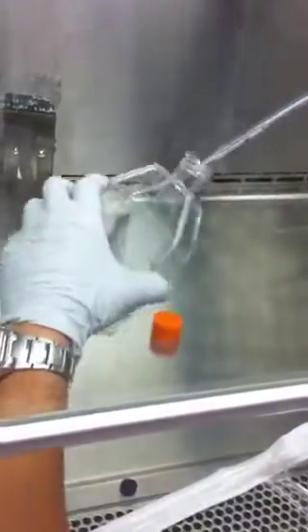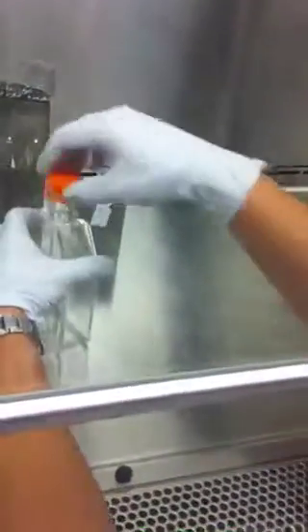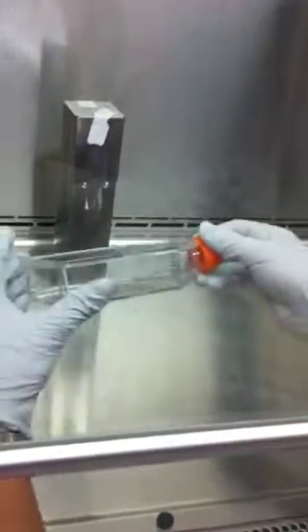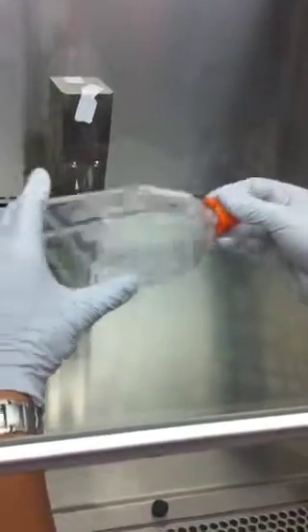So these are also sterile. They are packed to be sterile, and you open them inside the hood, not outside. See his technique? He's not pulling them out till he's ready to use them. It's important to keep things covered if you are not going to do anything with them. So again, just add the trypsin and flow the liquid around to cover every place.